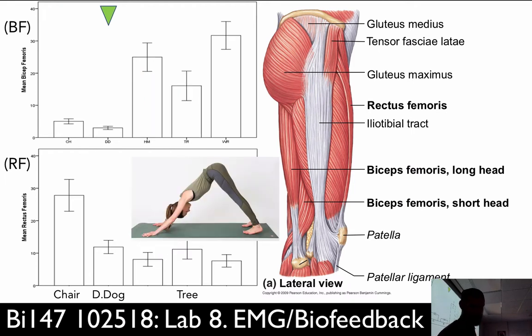Let's look at this pair with downward dog. All right. Downward dog has us again releasing bicep femoris. This makes sense because in downward dog we're trying to stretch our hamstring, posterior compartment. Rectus femoris in most of these people was actually still not especially engaged. This number was kind of low. I believe that that number could be higher. This is an equivocal number to me.